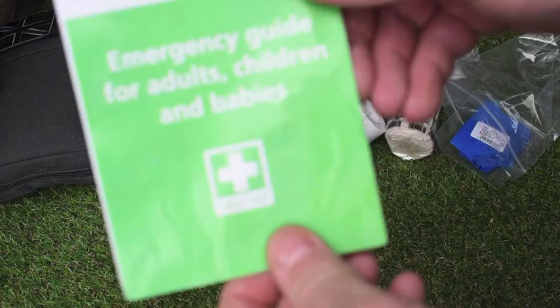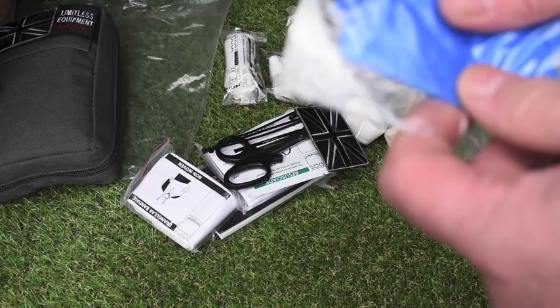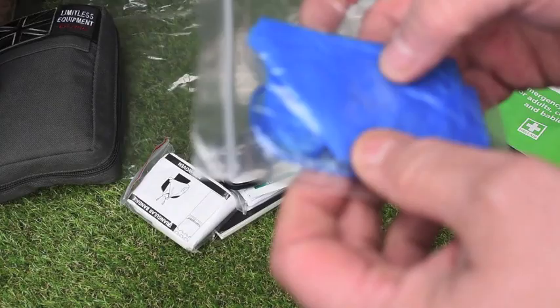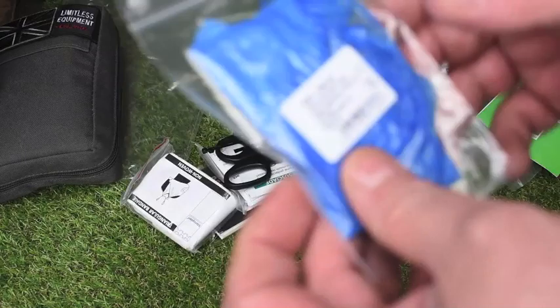What I like about this is it's everything apart from the pouch, so it's extremely good value. There's an emergency guide inside — for adults, children, and babies. Prompts are always brilliant to have; you won't always remember everything when you're treating someone. These are brilliant prompt cards. The gloves come in at two — vinyl powder free, medium. Always check the sizes of gloves when you first get a kit. I change all mine out to extra large, which I buy from St. John's in packets of two for about £1.50. I'll keep these mediums for the daughter or something like that.